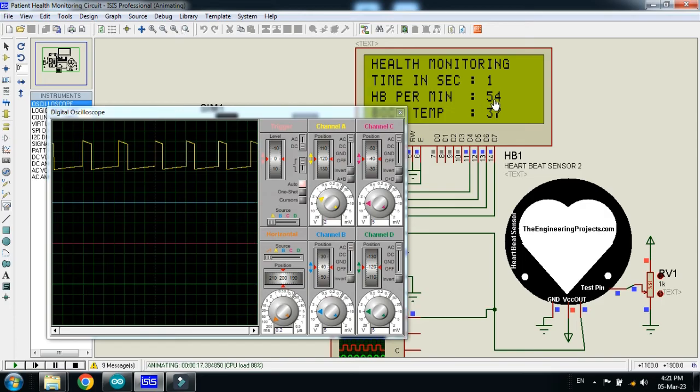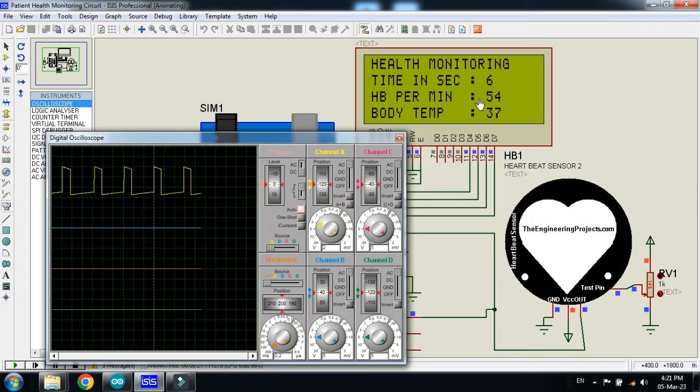You can see the heartbeat has now reached 54. If I change the value, you can see it on the screen on the display as well. After every 10 seconds it will show the heartbeat per minute and then start again.